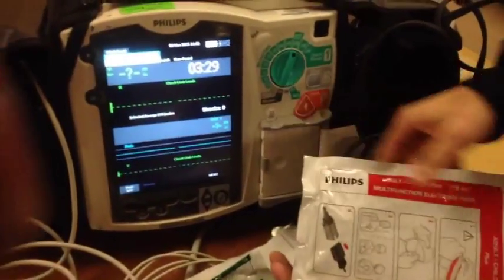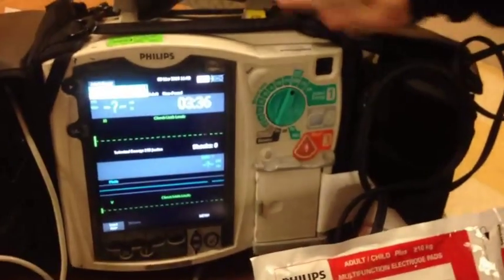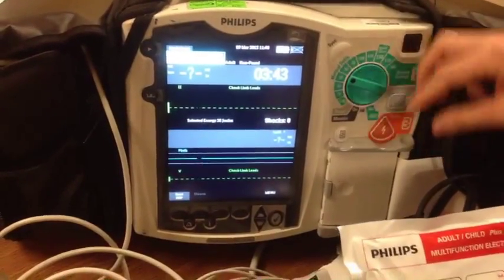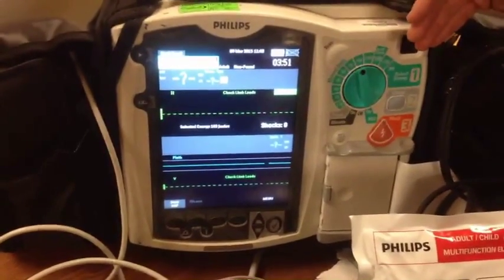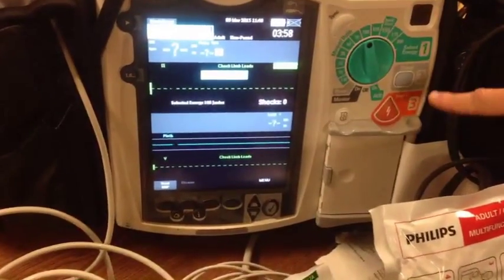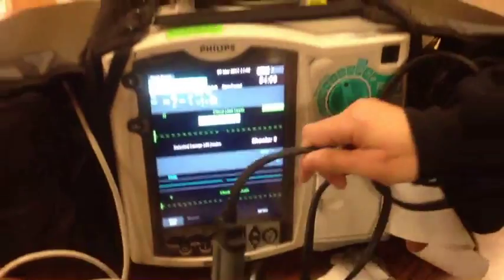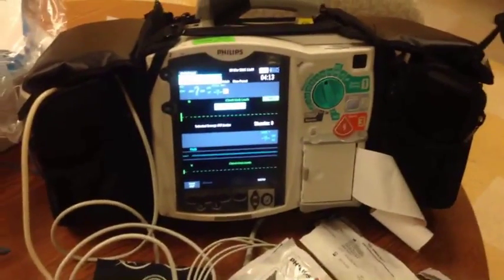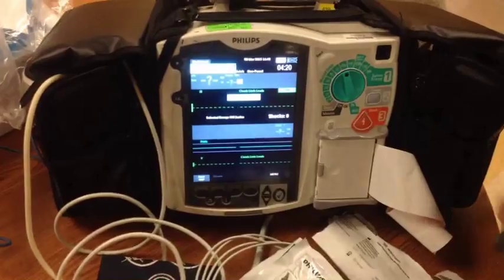Conversely, if you wanted to pace a patient or synchronized cardiovert a patient, you have those options as well — simply by backing your menu up, selecting your desired joule setting to cardiovert at, and then hitting the sync button to make sure that you have your R waves flagged. You'd then be able to start viewing an EKG with R waves flagged, charge, and deliver the synchronized cardioversion. I hope that's a nice brief overview to get you going. For any further questions, please refer to one of the SCTU nurses or refer to the manual that is also in the crew room of SCTU 1. Thanks.